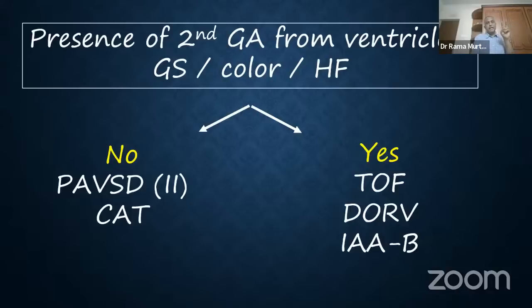So that is as far as the second artery goes. It's easy to understand because if the aorta is overriding and the pulmonary artery is atretic, pulmonary atresia with VSD, you may not see it at all. It may be just cord-like, right? Or if the pulmonary artery is arising from a common arterial trunk, then it is not arising from the ventricle, so you can't call it a great artery, isn't it? Whereas in all these conditions, you do have a second artery, and the second artery generally is a narrow artery, with the exception of interrupted aortic arch, which we will come to a little later.